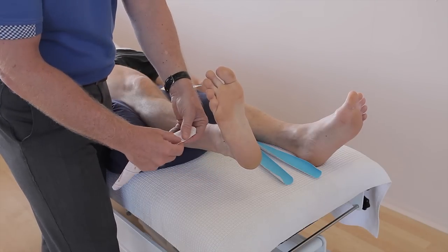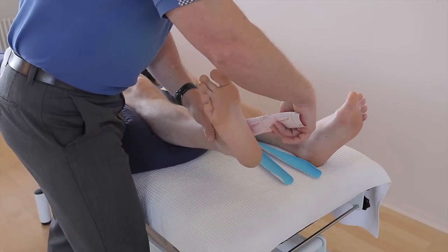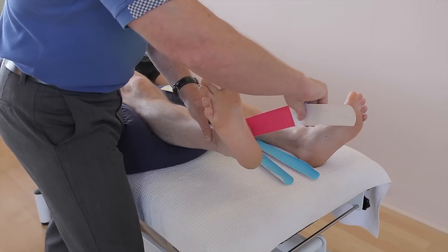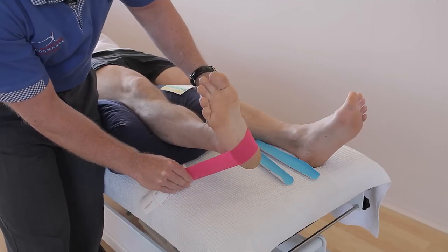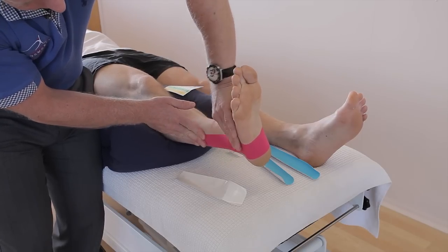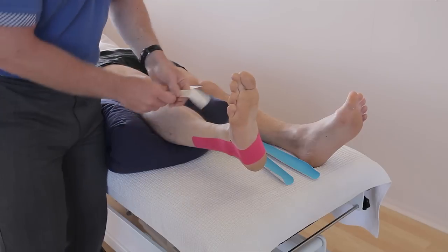We intend to split the tape on the first square, and then from there this is going to go onto the medial malleolus just above, and we can just lock that down. Pull the tape and that will just break the back in. Now peel that back to the first square, two or three fingers, lock it down, 100% stretch — come all the way around the lateral side, stick that down, then no stretch at the ends. Mold this around, and you'll see I've just crossed the ATFL and I've crossed the CFL. That's the first part.